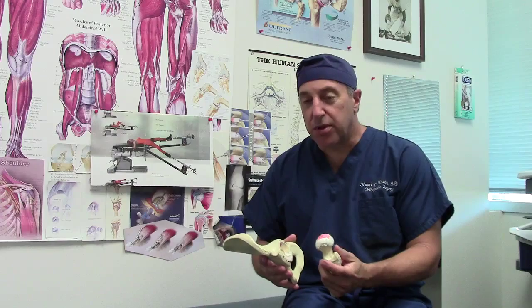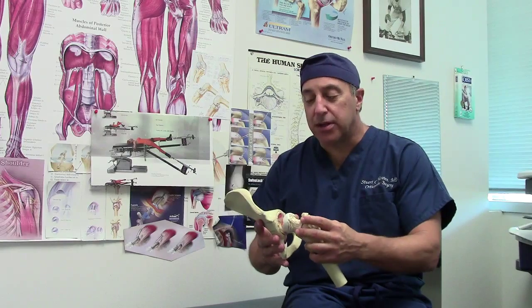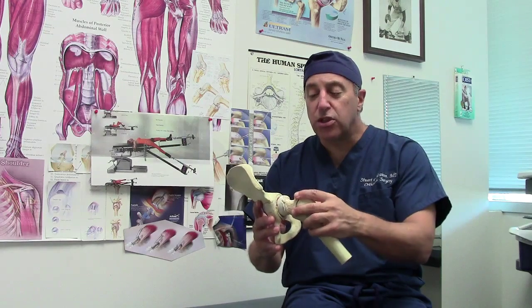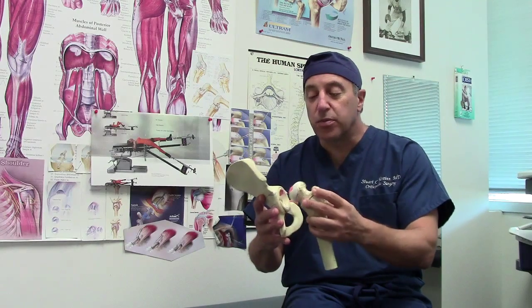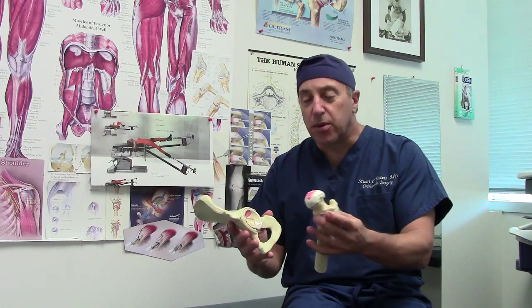I want to share them with you. Just as a refresher, I want to point out what we're talking about — hip arthritis. In this model, the red area is the cartilage that's worn away, and so you get a bone-on-bone grinding. The goal of any hip replacement is to replace the joint's surfaces with a cup and a femoral component.